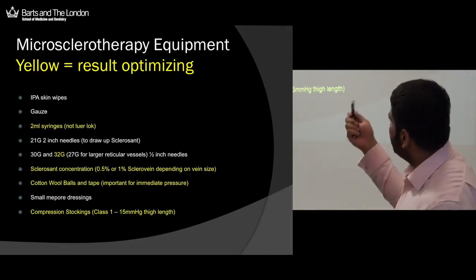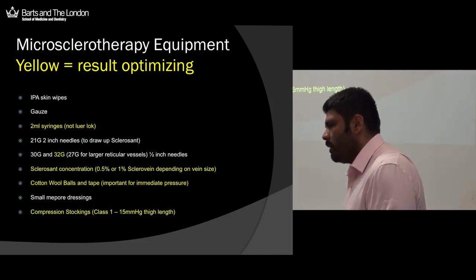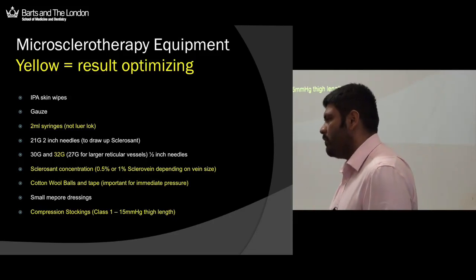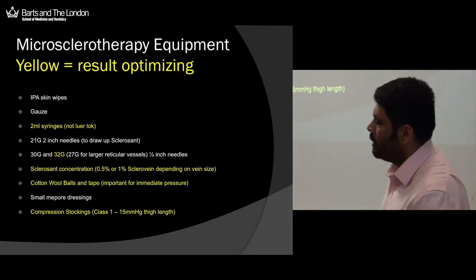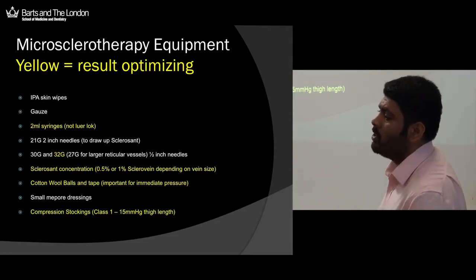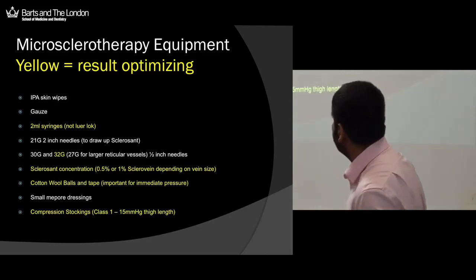So 2 ml syringes when we're injecting sclerosant are important because very often I've seen this procedure done with a 1 ml syringe, and what happens is the extrusion force that you are effectively creating with a 1 ml syringe is very, very large, and small telangiectasia in the leg will often blow out or be damaged, and then you can get bruising, post-inflammatory hyperpigmentation, other problems from that, just because you're causing more damage to the vein than actually contracting it and sclerosing it and closing it down.